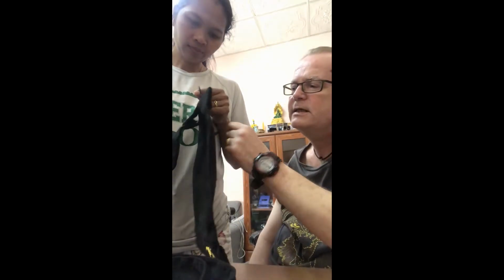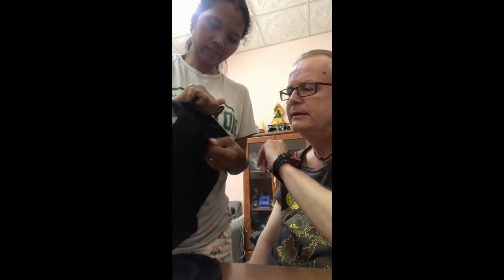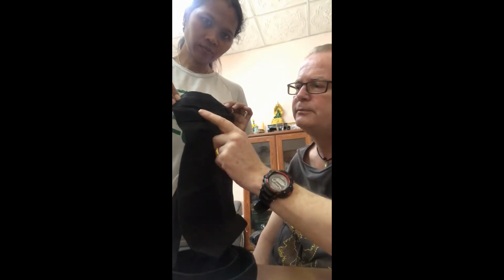So basically, May's going to take off the hanger here, and she's going to open the top of the bag. Now, purposefully, we've used heavy duty Velcro, which has been reinforced. The sewing has been reinforced as well, because especially this top one is going to be open a little bit, but the bottom one's going to be open more so because you want to empty the bag. So this is Velcro, and also if you notice at the top here, there's plenty.